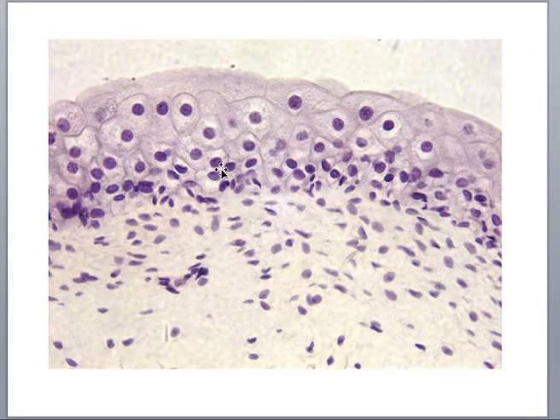So this is transitional, but it's definitely multiple layers of cells. These are not columnar, right? And these really super fluffy balloon-shaped cells, those are dome cells towards the apical surface. So these cells can slide past one another to expand and be flattened as the bladder fills with urine.